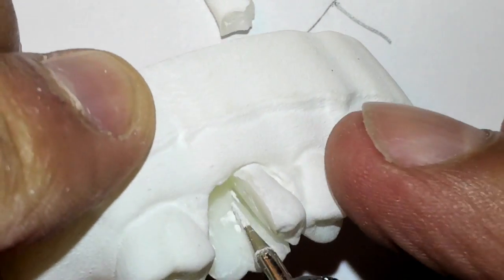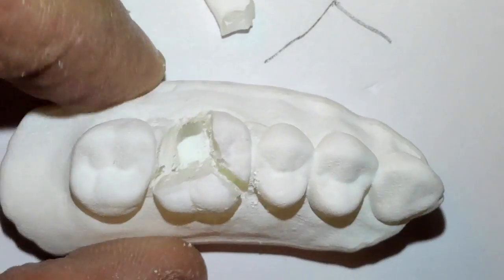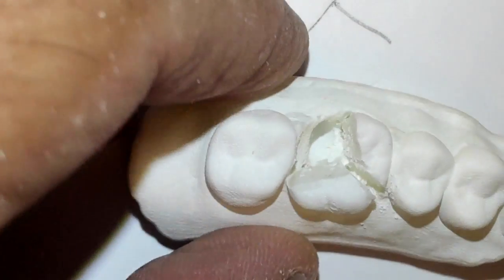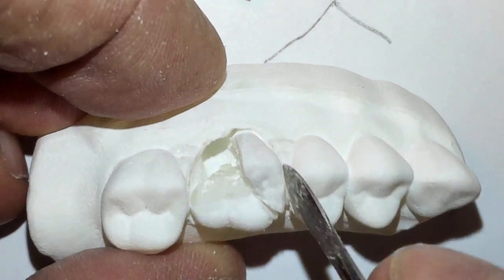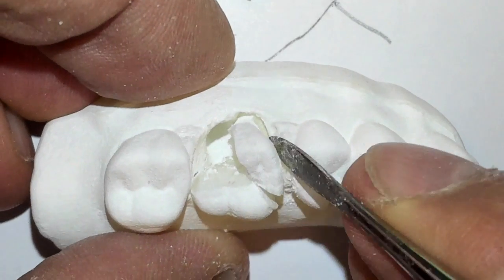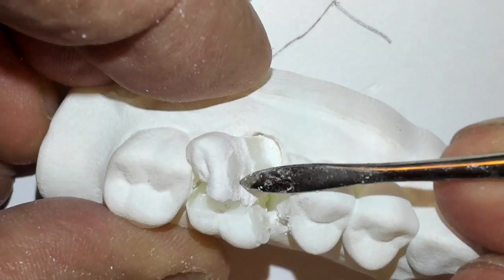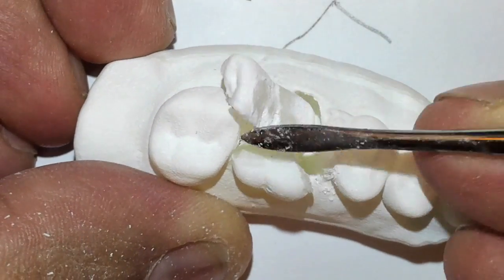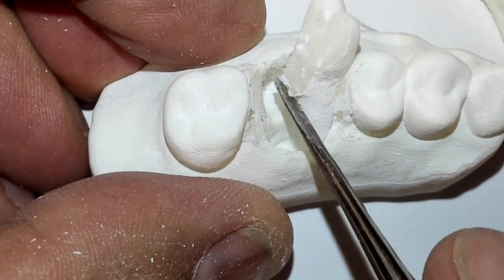Just go in and section some more, then place your instrument. That's the palatal root — let's see if we can get it. Here's the mesial buccal root; that should come out next. We'll elevate that out nicely. And then the last one should just pop right out like that.